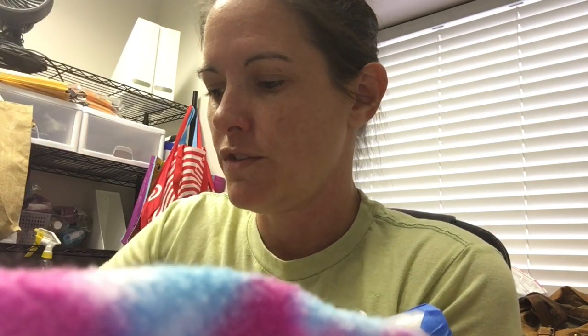This little guy weighs just a little shy of 200 grams, so we're going to go ahead and do eight. I'm going to fill up my syringe, and then I'm going to add my tube to it, and I'm going to push out some milk to get all the air out of the syringe and get down to the number I want — I want it down to eight. Perfect.